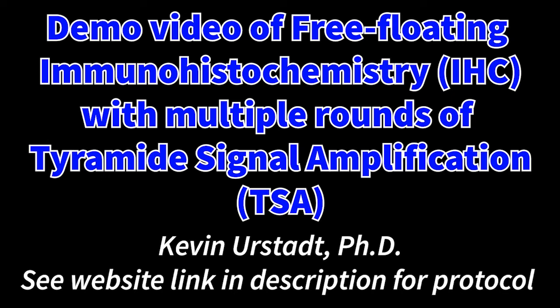Hello, this is a video demonstration of free-floating immunohistochemistry, also known as IHC for short, with multiple rounds of tyramide signal amplification, also known as TSA for short.